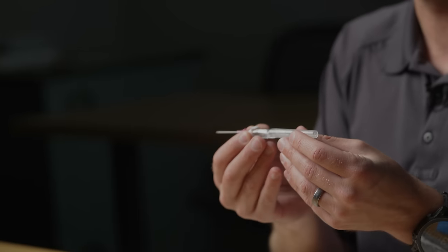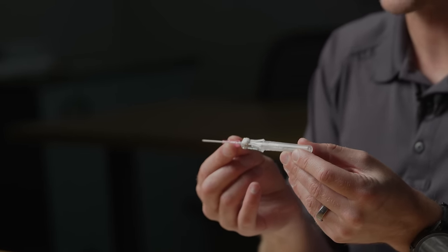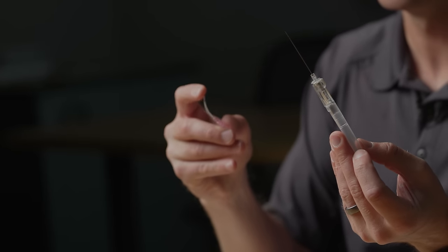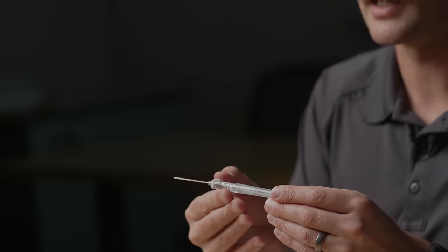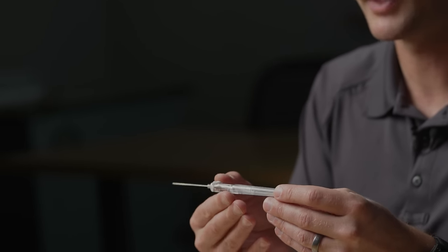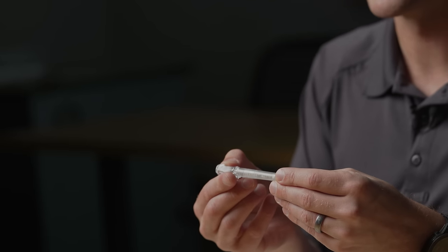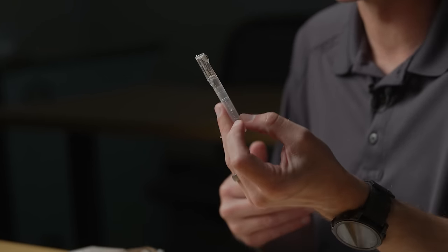You'll notice this is a safety catheter and almost everything on the market is going to be a safety catheter anymore. As I put this into the vein I've got that flexible catheter that stays in the body, and then I've got the needle. This is a spring-loaded retractable device — as I pull it out I can just hit that button and it will retract the needle in and hopefully limit the possibility of needle sticks.